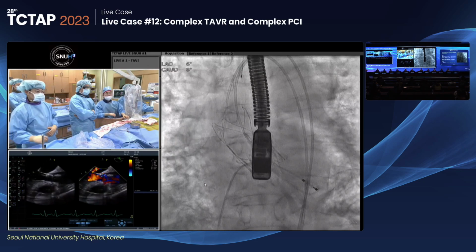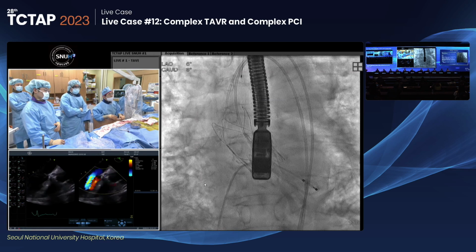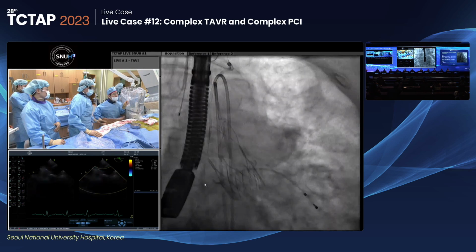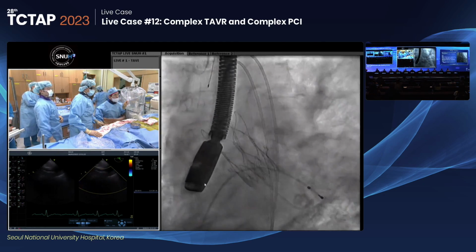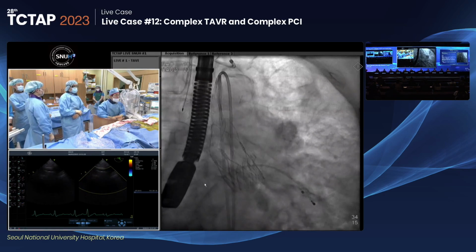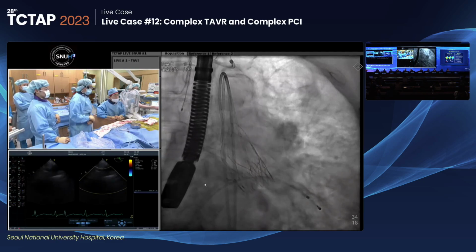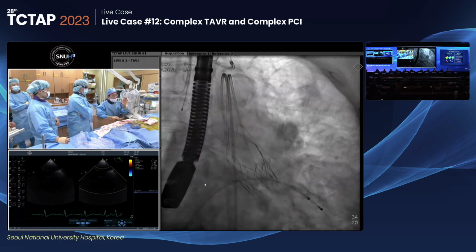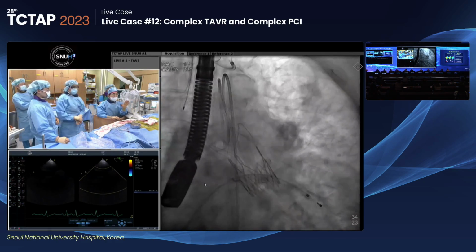Mainly intravalvular. Let us check the full expansion of the valve frame by rotating fluoroscopy. Start caudal, cranial. As you can see, the smallest diameter is in the caudal view and a little bit expanded on the other projection angle. This is valve 20% oversizing on actual diameter base and 10% oversizing on nominal diameter base.